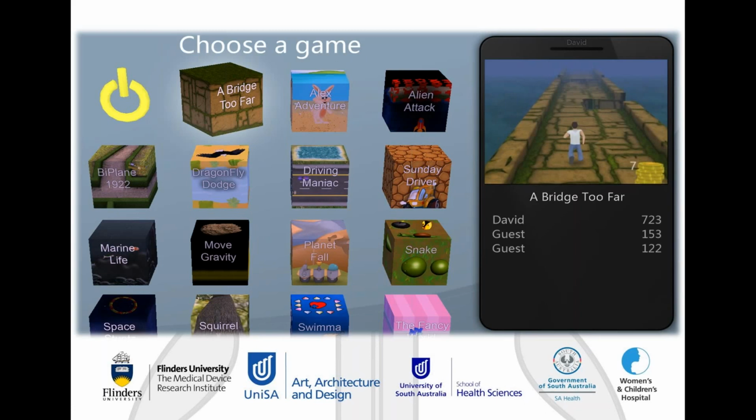So it was actually a very good motivating pull to get the child to come back onto the gaming system to ensure that their name was on top of the high score table, and this said Luke or Sally or whatever the child's name was. So this was a very subtle but very good way to get the children to get back on the gaming system and play it so their name was top of the leaderboard, so to speak.